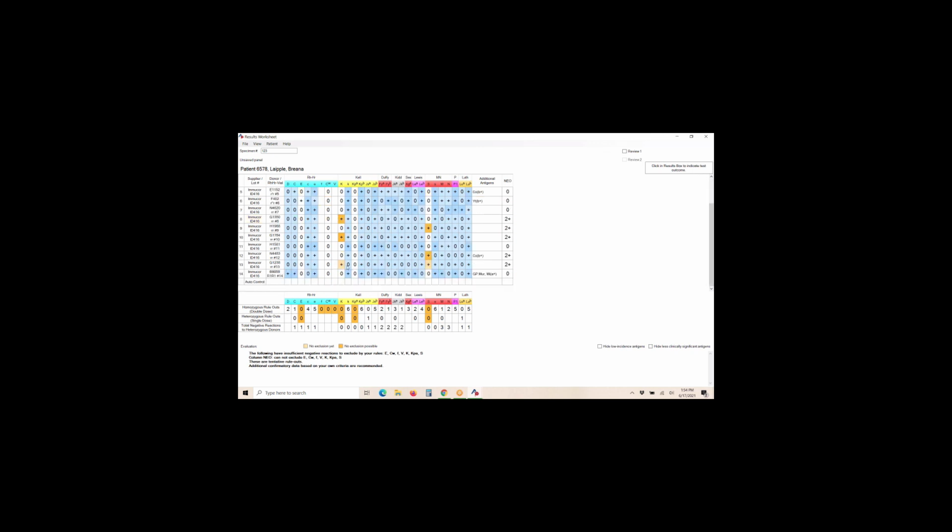And down here was the example I told you about before, where yes, it looks like there's a K and a big S, but since they're both positive here, probably both of them are contributing to this 2+, but we can't assign the specificity, this 2+, to one or the other. It's because of both of them most likely. So we can't use that as a way to rule in the antibody. So therefore, it's not going to be dark orange.